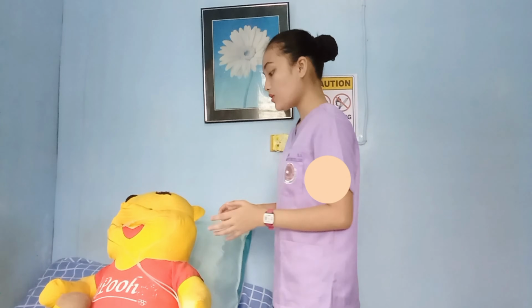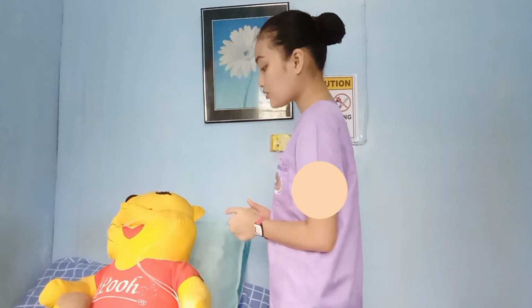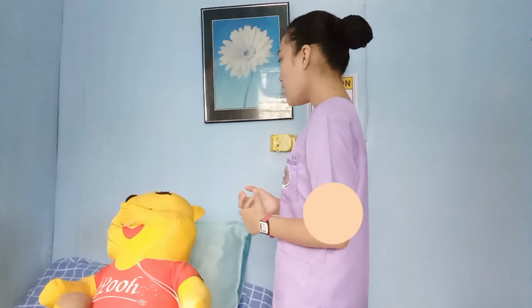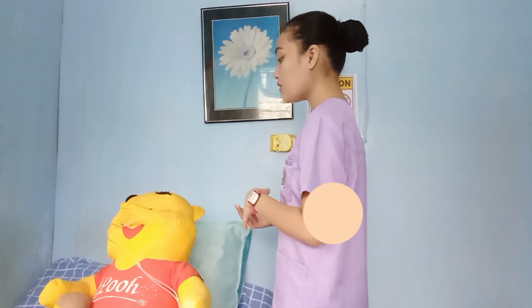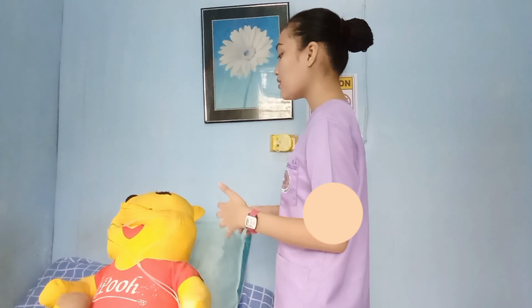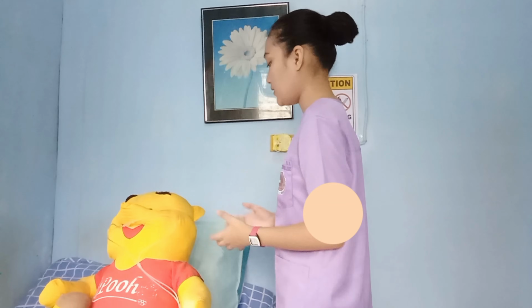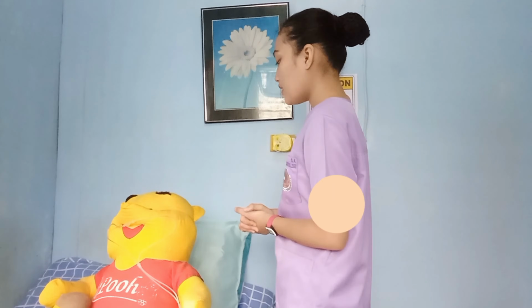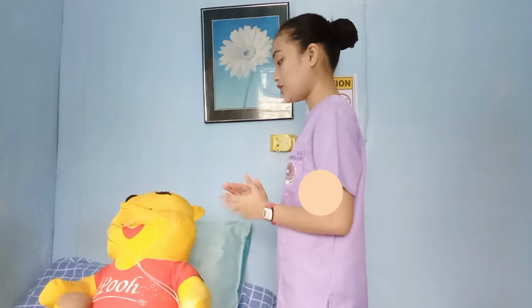Okay, sir, is the cannula comfortable? Is it too tight or too loose? Okay. Just relax. I encourage you to breathe through your nose and then out through your mouth so that you can get the maximum amount of oxygen that we are trying to give your body. Okay? And just relax. I am going to stay here with you to monitor your condition.